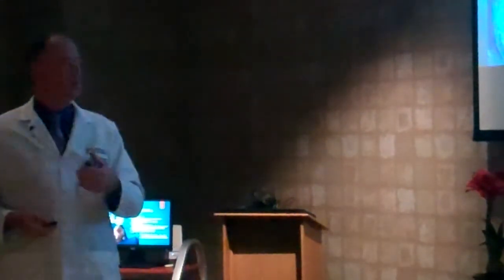Now, it can have a little bit of error, there's a margin of error, a couple of millimeters. That's why you can't just take one of these machines and start doing sinus surgery on your own. You have to know what you're doing before you use it. It's a tool to help us in special cases.